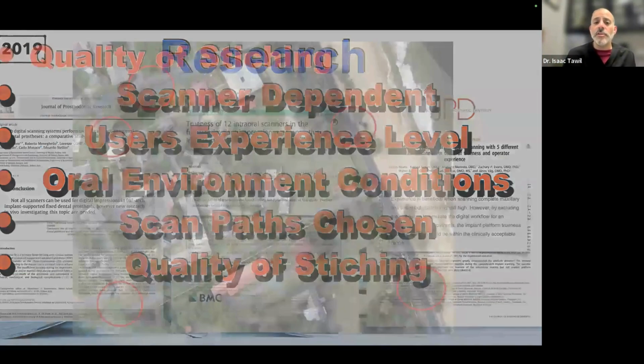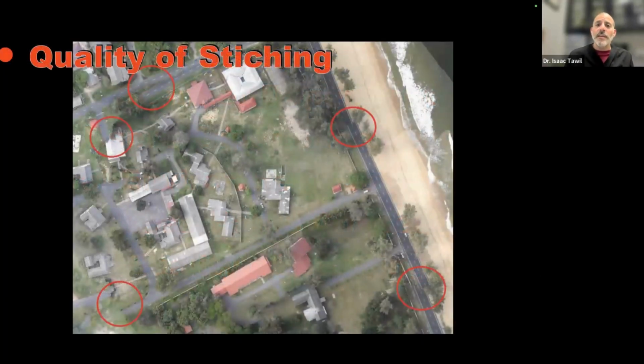So if we think about this logically, something that we all do every day, we may use Google Maps or Apple Maps, and you may look at the satellite view. And this is Google Maps, which has very, very high technology. But look at the circled areas. These areas are deviating. They did not line up and stitch correctly. So it took a picture here, it took a picture there, and it didn't match up.